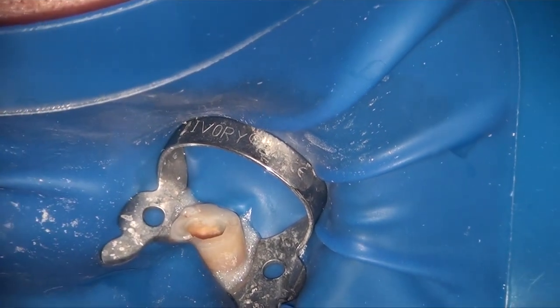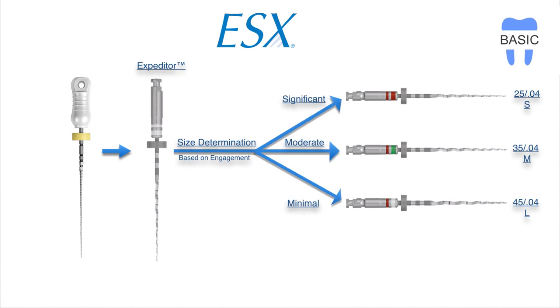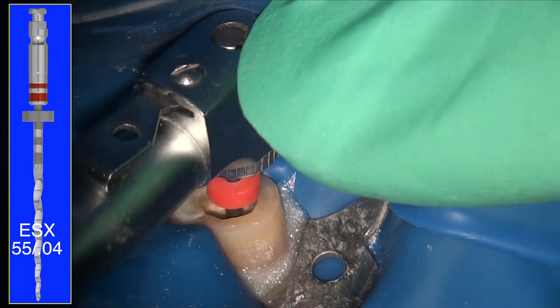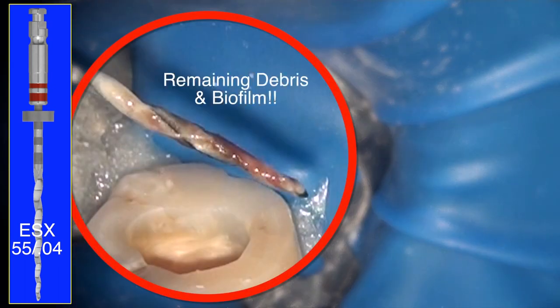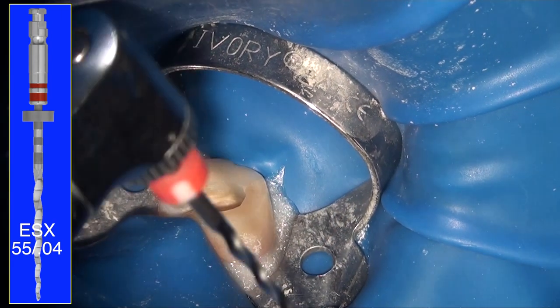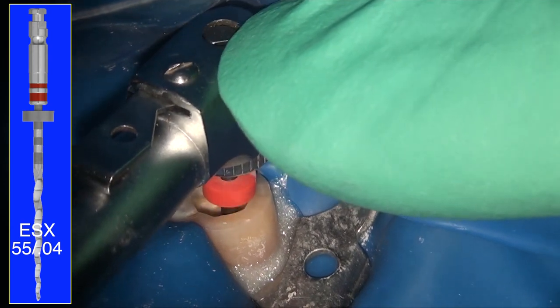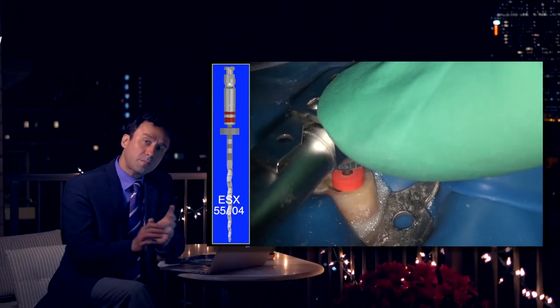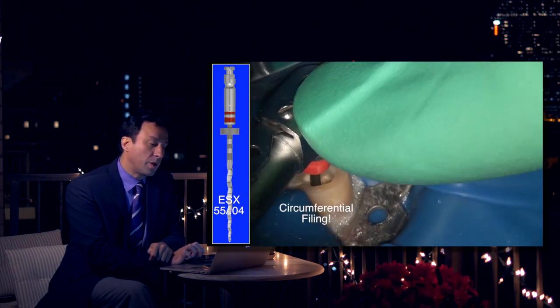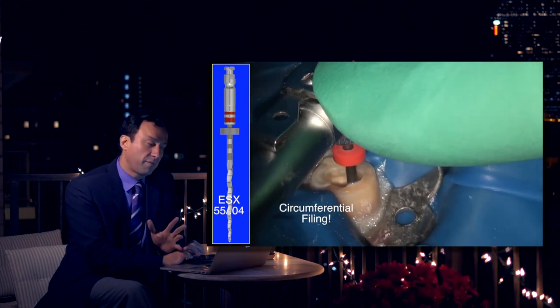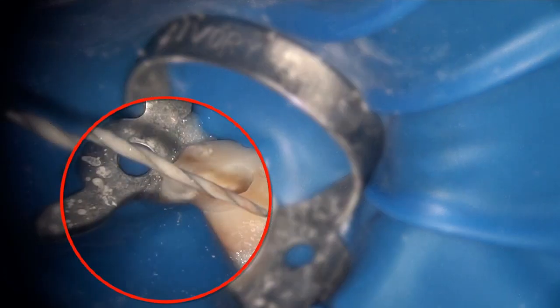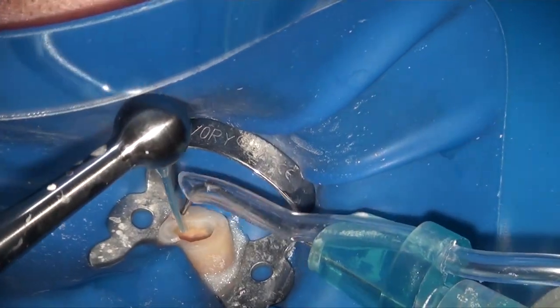What happens when the large file goes all the way down to the end? The ESX protocol tells us that if you have a 45 that's loose in the canal, use the 55 ESX file. You have four finishing files available. The 55 goes all the way down, and in a couple of rotations it engages quite a bit of biofilm and debris left on the canal walls. On the second stroke the 55 also reaches the apex and is now making contact with the dentinal walls. I'm doing some circumferential filing to clean the debris off the canal walls, and just a little bit of circumferential filing is important. We're getting cleaner dentinal chips, so we'll move to an irrigation protocol with a size 55 shape.